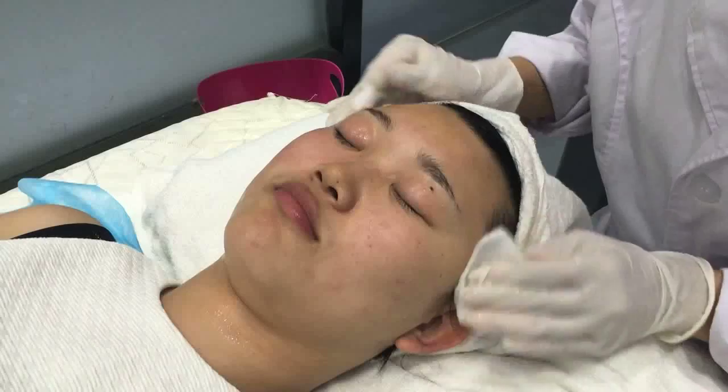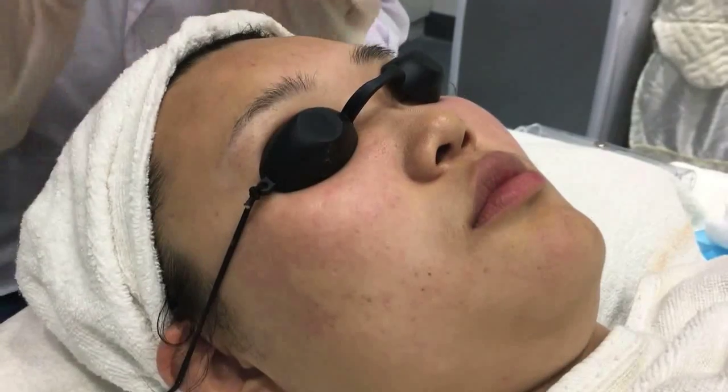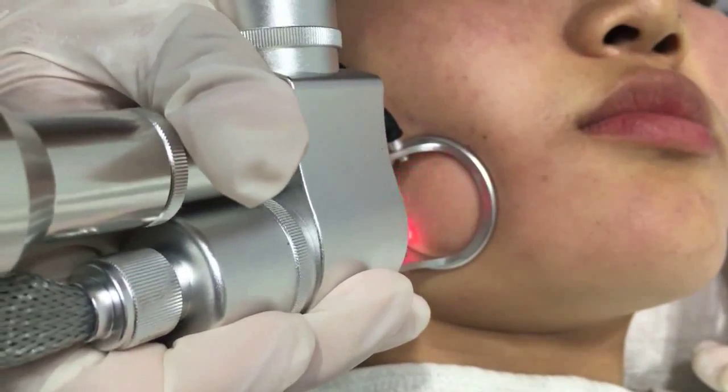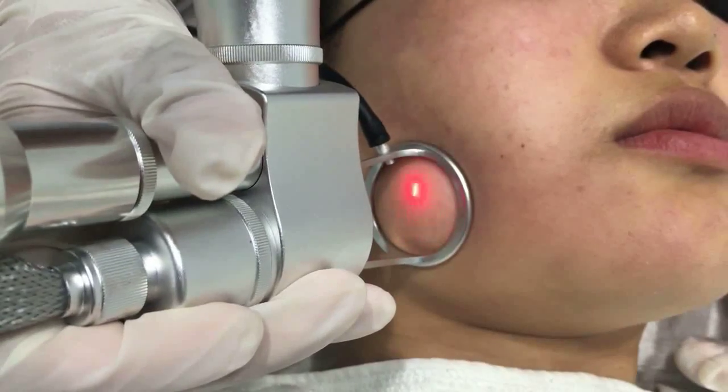Procedure of treating: clean the treatment area. Wear eye patch — during treatment the client needs to close eyes. Adjust the parameters. Click the start button to begin. You can adjust the parameters during treatment according to customer feelings.